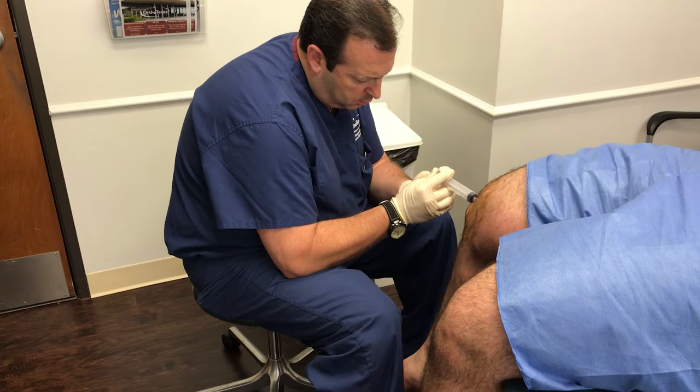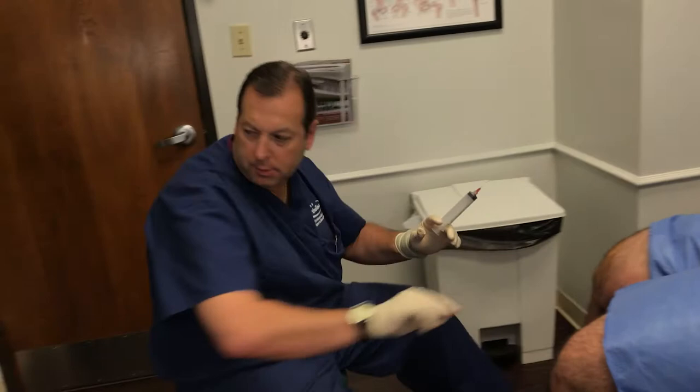We are just about done there. All done. As far as the injections, we are all done.